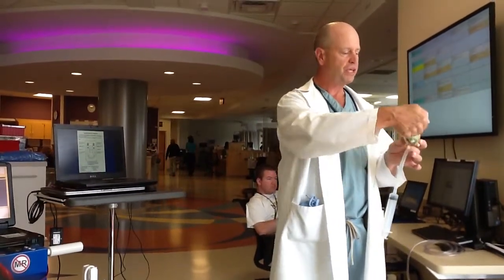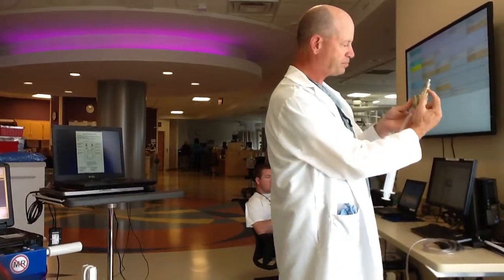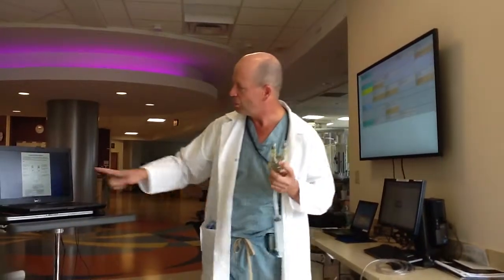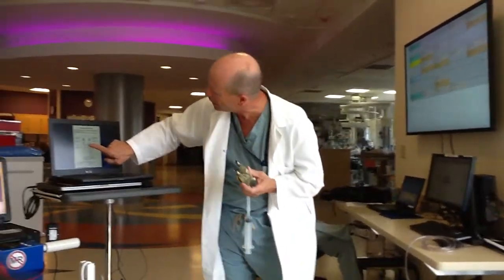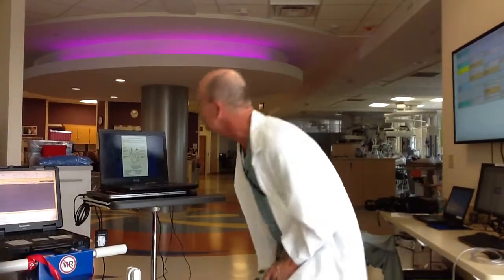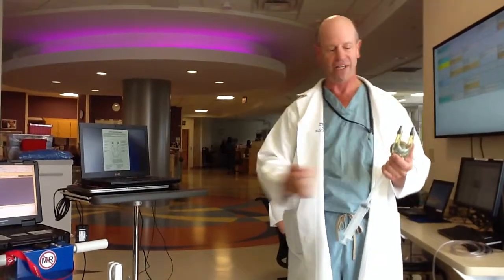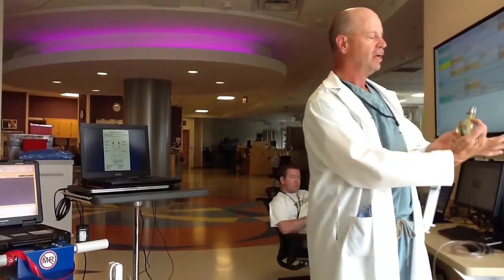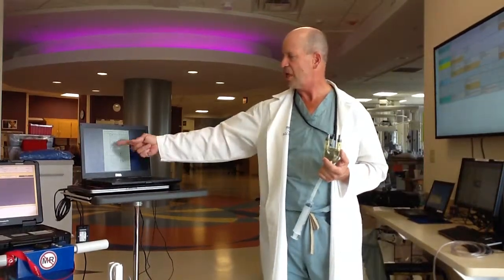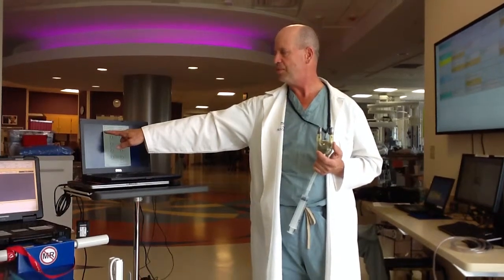If you see a thrombus — say on the outflow of the pump up near the top — we would look at area number 10 according to the sheet. If we saw a thrombus there, we would go to this side of the page to record that thrombus.